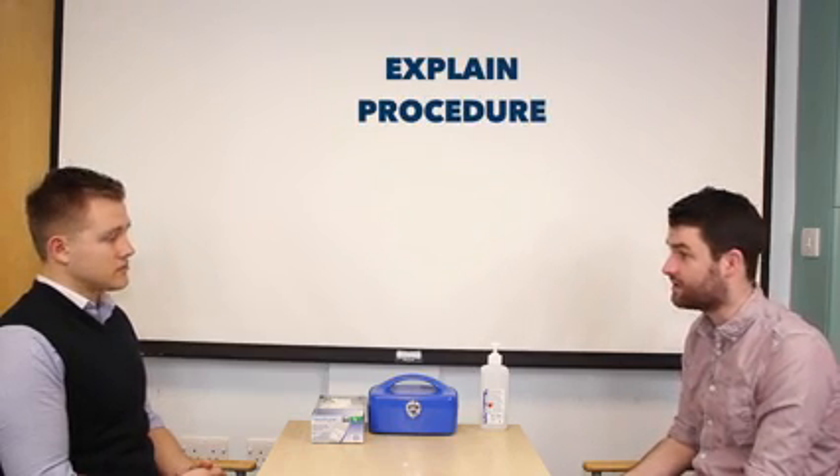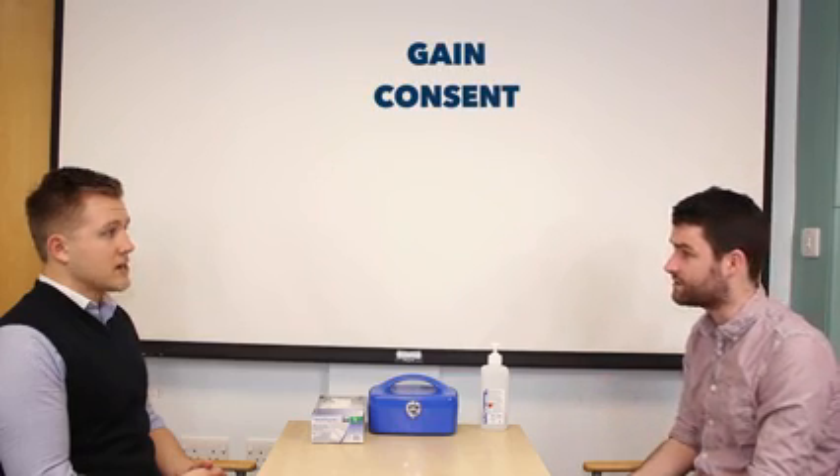Nice to meet you, Andrew. So today I'd like to check a blood sugar reading if that's okay. That'll involve me taking a small blood sample from the end of your fingertip. Does that sound all right? Yeah, that's fine.